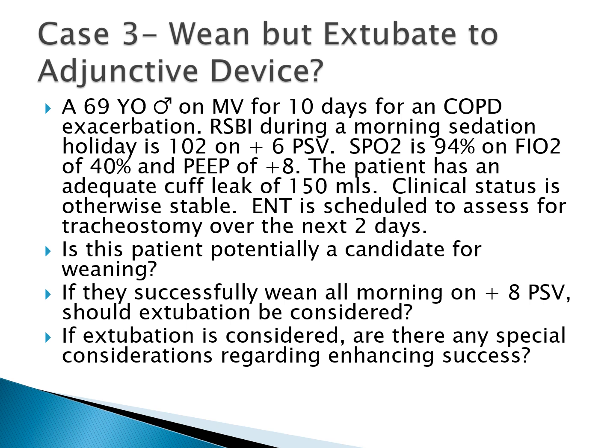The caveat is if the patient has a small tube, if it's an adult patient with, let's say, a 7 tube. We typically don't use anything smaller than that unless something odd is going on. We have a very active head and neck surgery team. They do a lot of cases, and occasionally these patients come out with small tubes because they have a lot of swelling in their neck, or they've had a tumor removed.